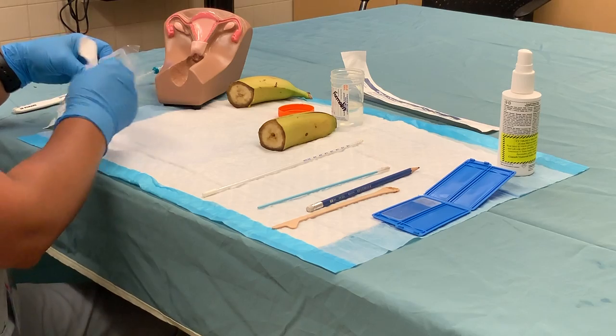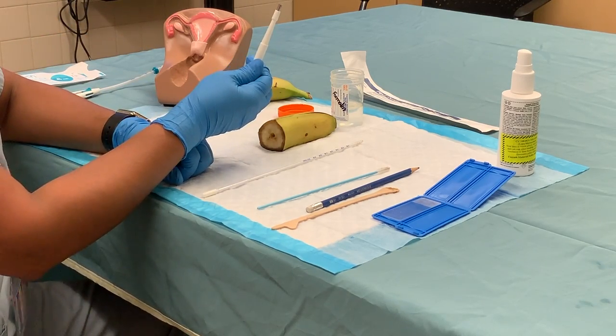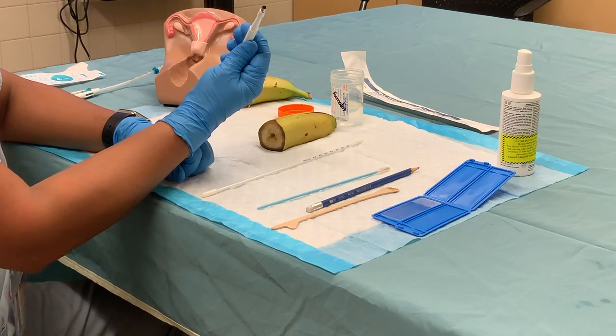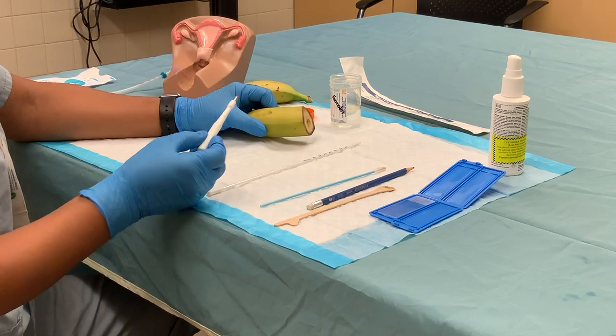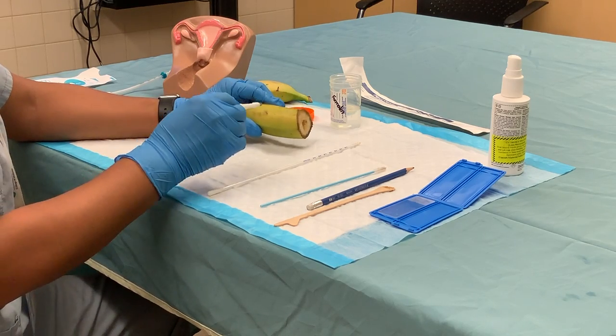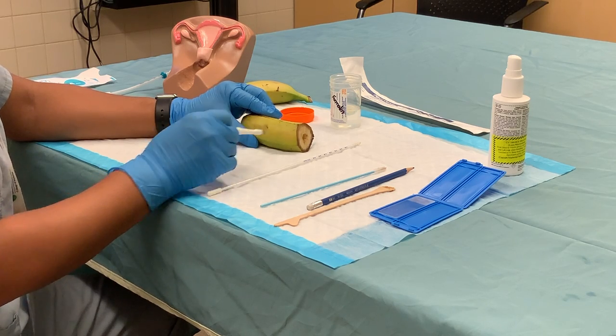Moving on to the vulvar biopsy — this is a vulvar punch biopsy instrument, four millimeters in diameter. I recommend teaching students to use the skin of a banana to practice performing the biopsy.